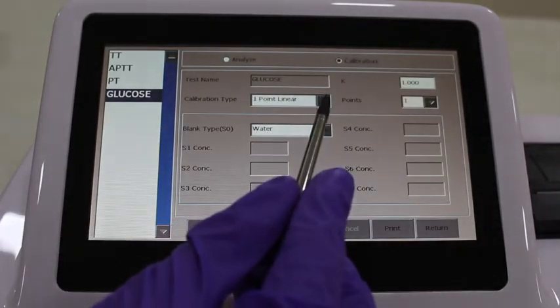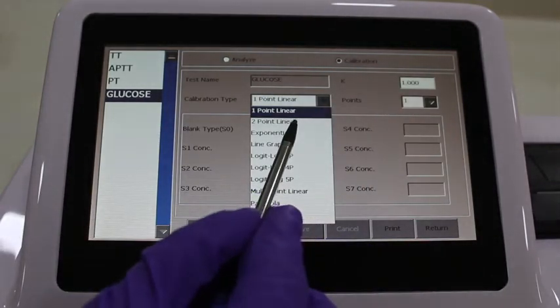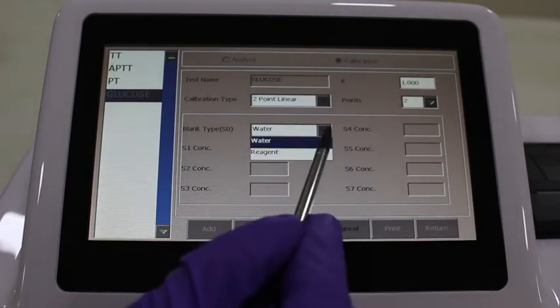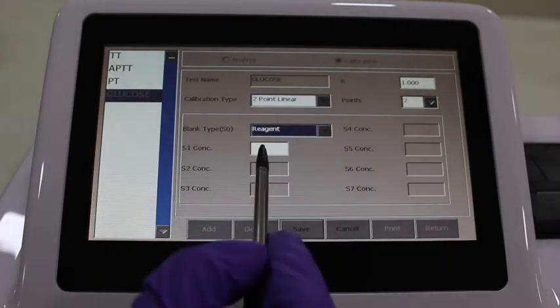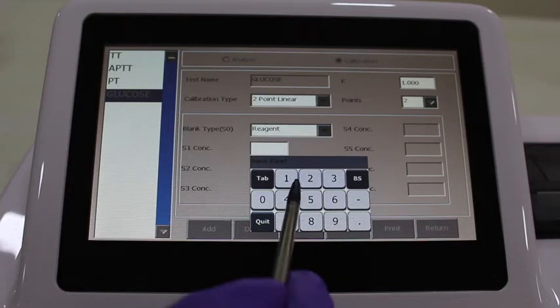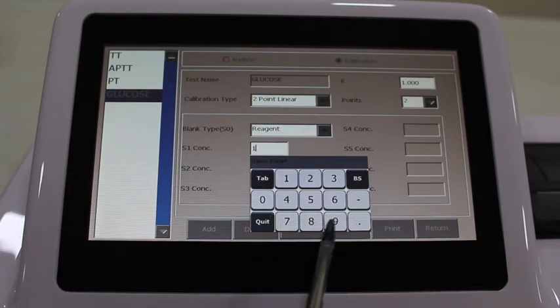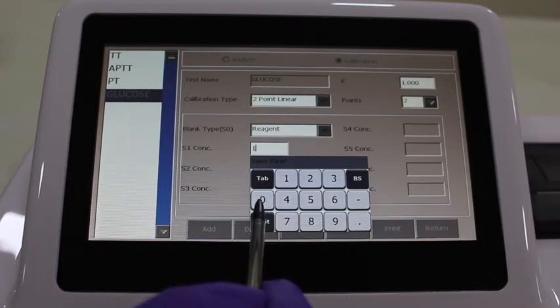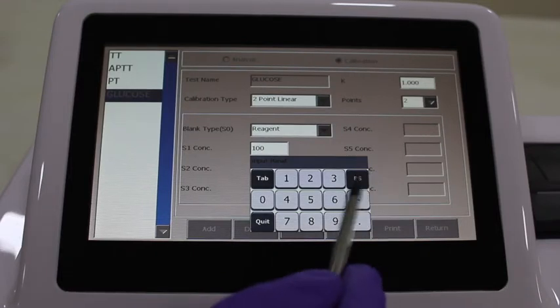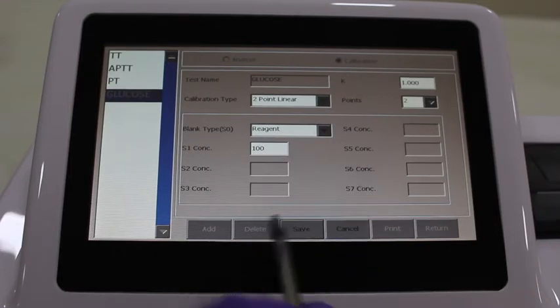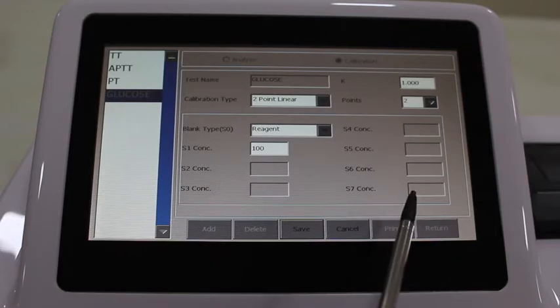Now select calibration option given on the top. Select calibration type as two-point linear and enter reagent blank. For all endpoint reactions, points select two to get one option of standard selected. Enter the standard value, then save the data. Remember to enter reagent blank for endpoint reactions.